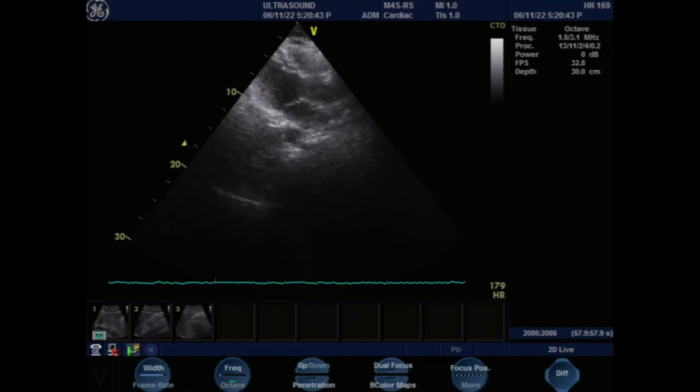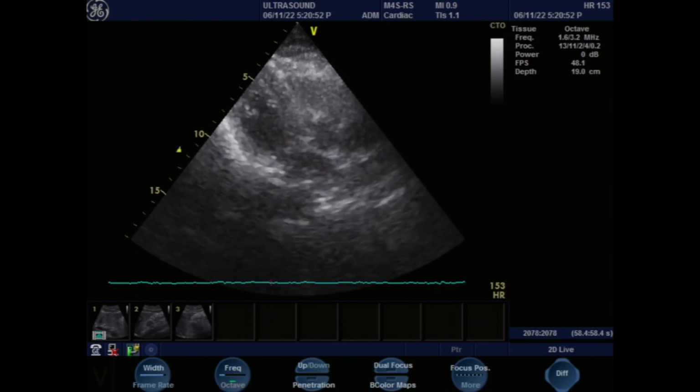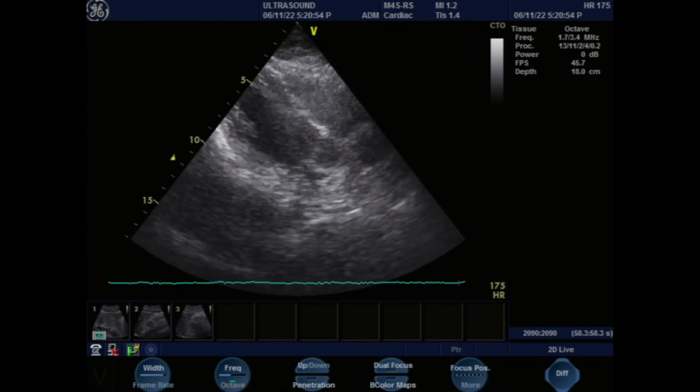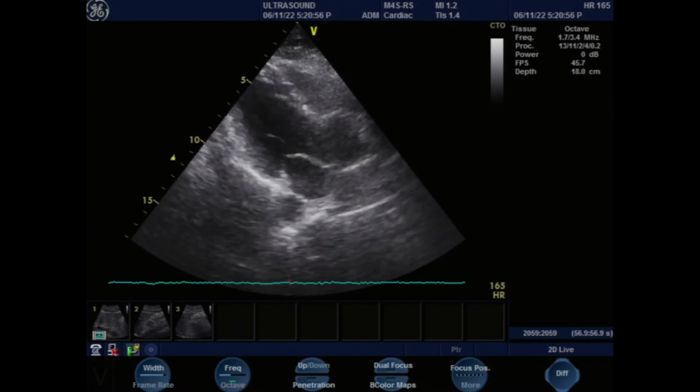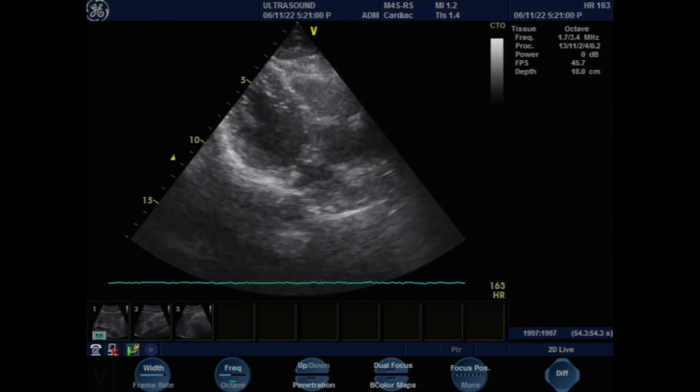There you go. And you're looking at the aortic valve right here. So now you're looking at the mitral valve here. Then you look at the descending aorta. And then you look at his right ventricle. So you look at oblique here, a little different view than what other people like. So you can see that the aorta is kind of like, instead of like this, it's kind of like that.